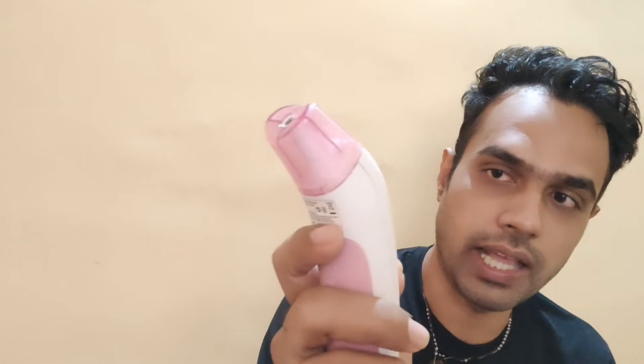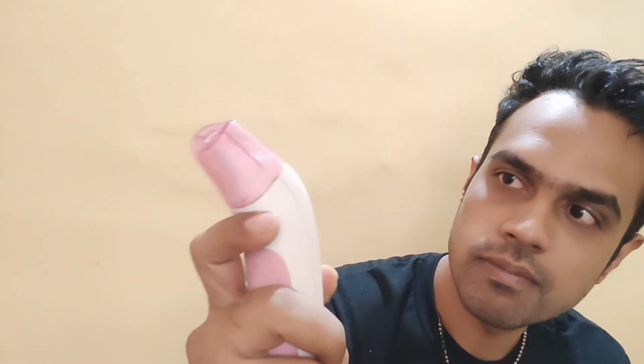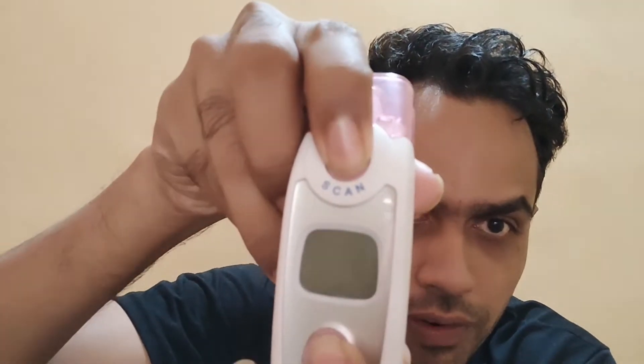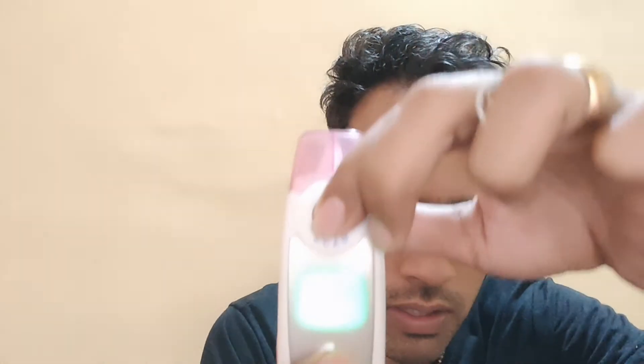If you want to exit the reading mode — say the readings are on and you need to exit — all you need to do is press F1 and F2 together and it will turn off. It's very simple. Similarly, if you're in forehead mode and want to switch to ear mode, press F1 and F2 together to turn it off first.